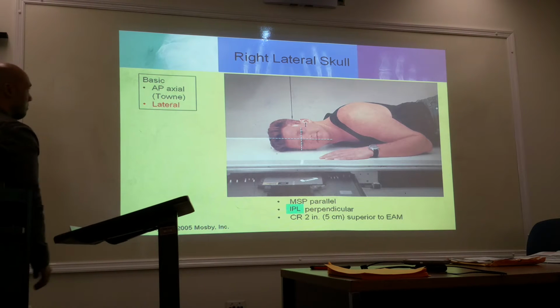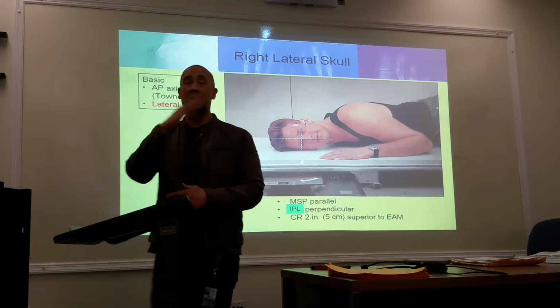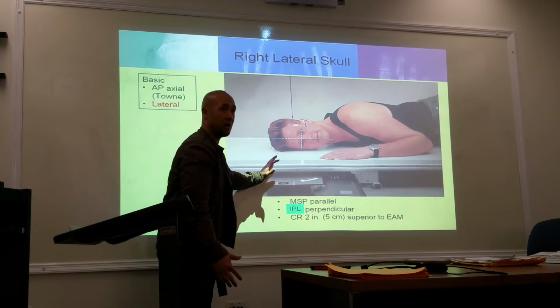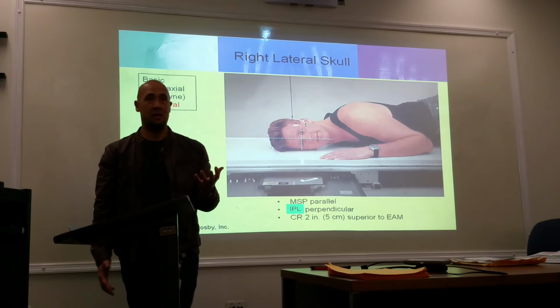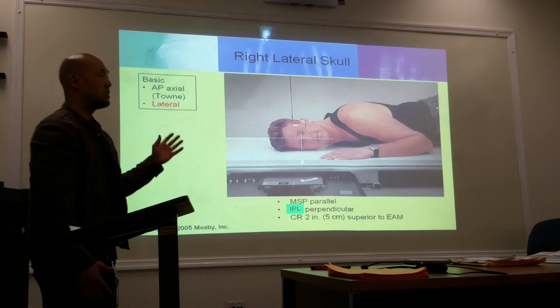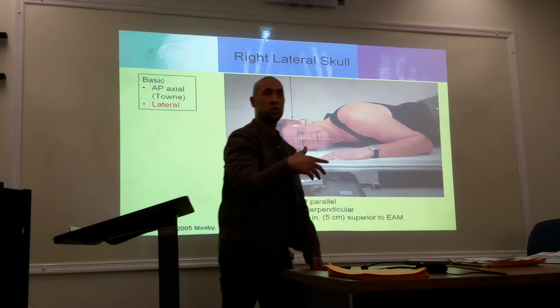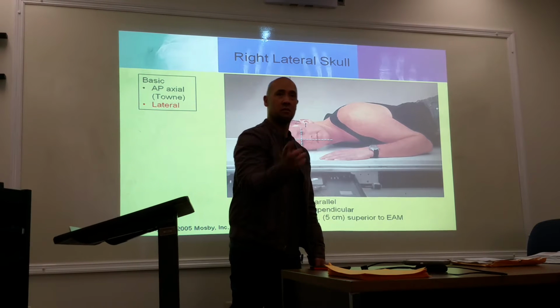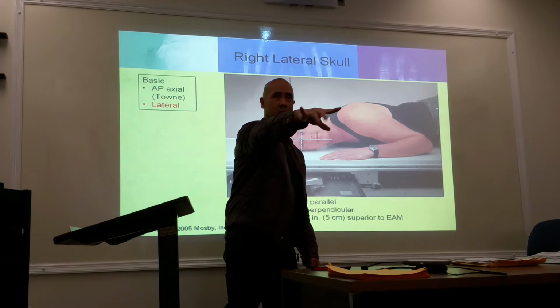Okay, a lateral. Laterals can be done on any side. If you injured the right side, it's going to be a right lateral. If the injury is on the left side, you do a left lateral. So it is specific to the site of injury. Some of your hospitals will say, well, just do bilateral. That's part of the routine. Anybody do some skull work besides you two?